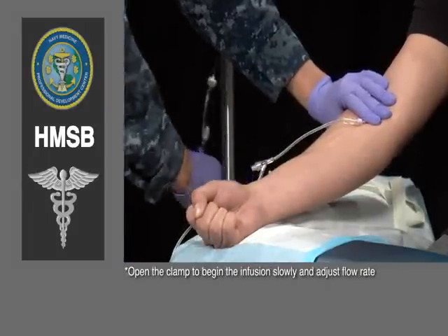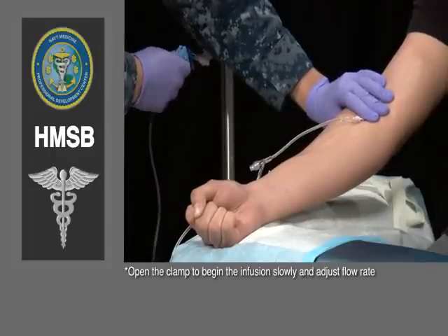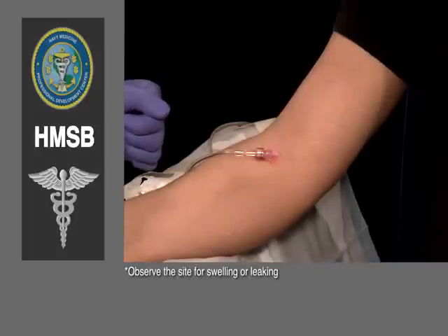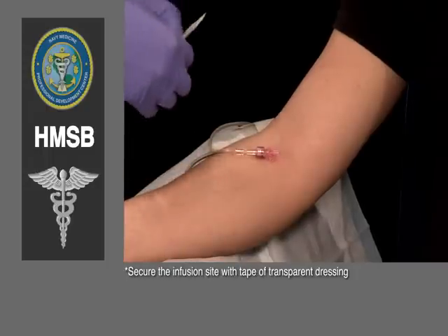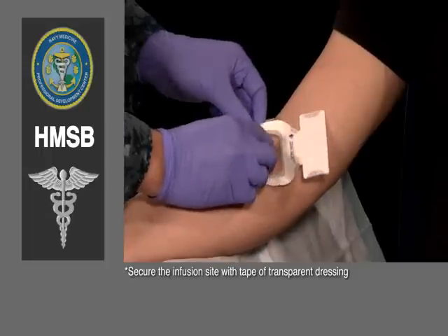With the connection secure, I'll open the clamp slowly to begin the infusion, and I will adjust the flow rate. I'm also going to observe the site for any signs of complications, such as swelling or leaking, which would indicate that the site is not patent. I will then secure the infusion site with my transparent dressing and tape.